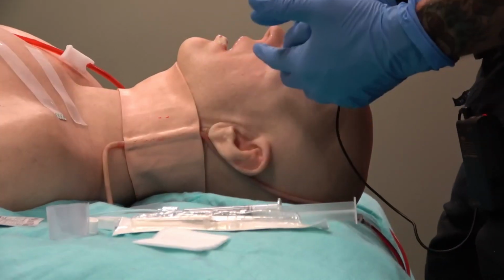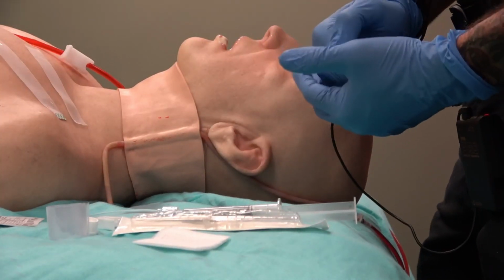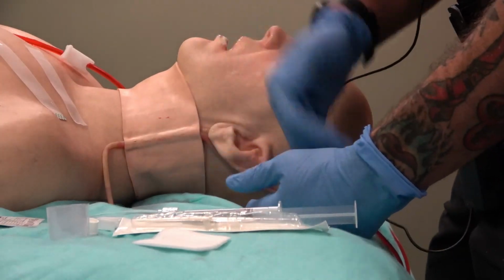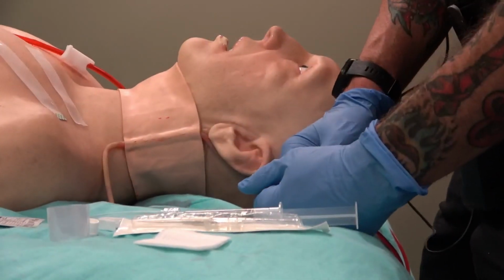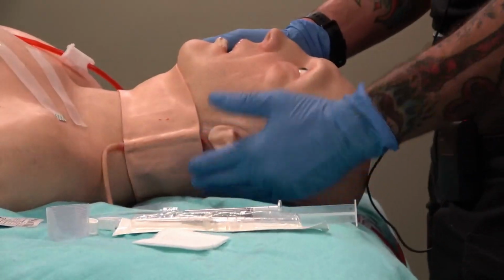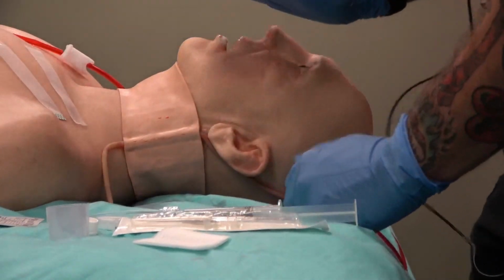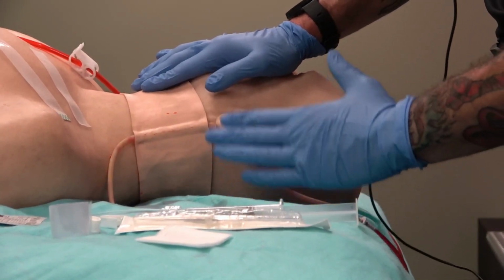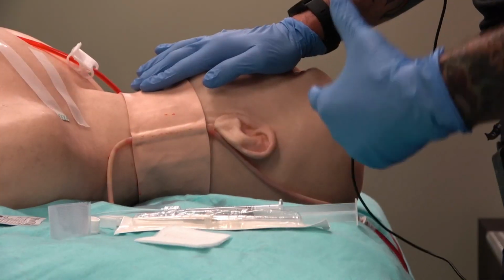So how do I actually go about getting an IV in here? It's kind of an awkward angle comparative to some flatter areas like an AC or a wrist or a hand. It's also at a different angle. It's perpendicular to me. And so starting this, I'm probably going to want to turn the head to the side, given I am able to do that with my patient's condition.